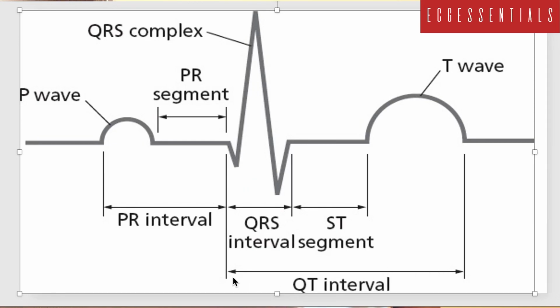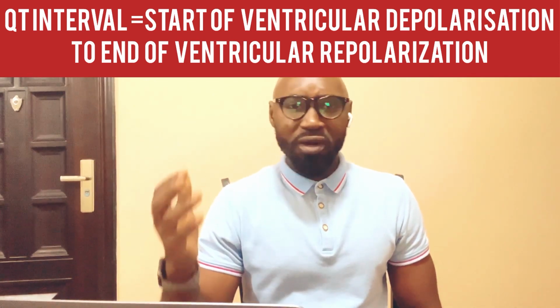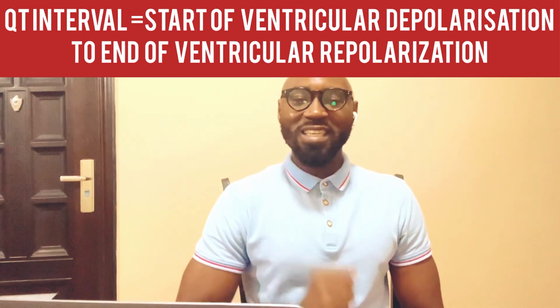Next, we see the QT interval. This QT interval encompasses the QRS complex, the ST segment, as well as the T wave. And of course, that will measure the time from the beginning of ventricular depolarization to the end of ventricular repolarization.